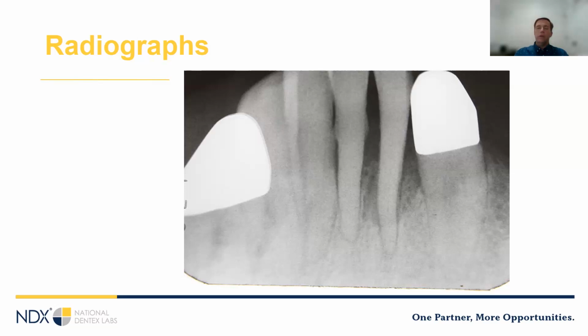Then you need to explain to them the differences in gingival lengths that are going to occur. And keep in mind that pink porcelain is kind of treated as a panacea, and it rarely is. What we often see with pink porcelain, especially in small segments like this, is that there's a seam all the way around the outside of it. And so it becomes pretty apparent what's pink porcelain and what's gingiva. If we adapt the porcelain nicely enough to make that go away, a lot of times we wind up with a very intricate ridge lap, which can be difficult for the patient to keep clean.